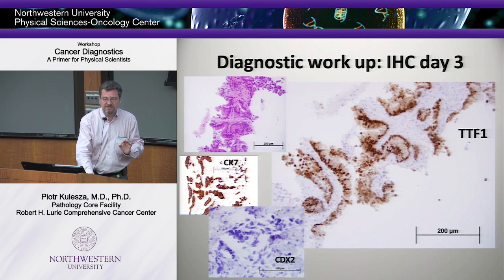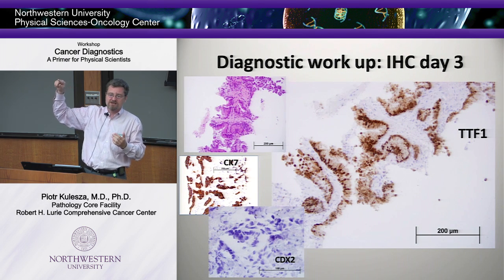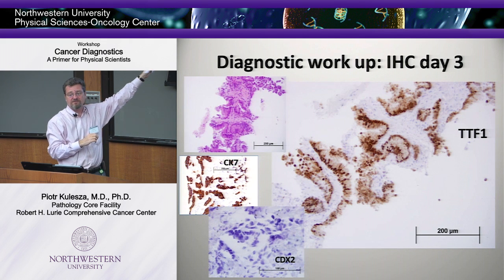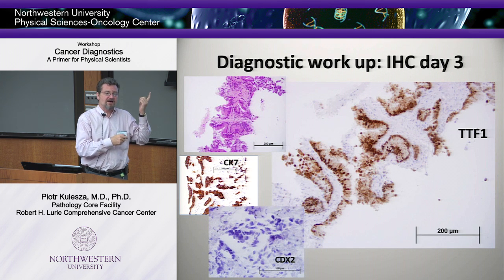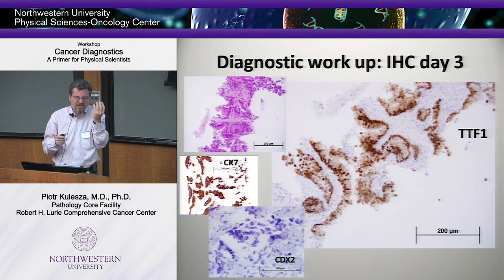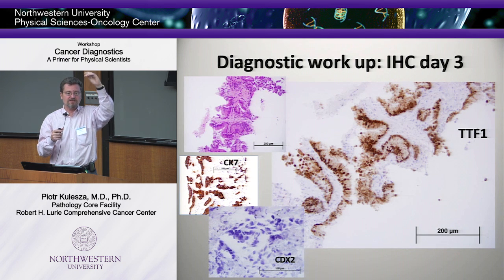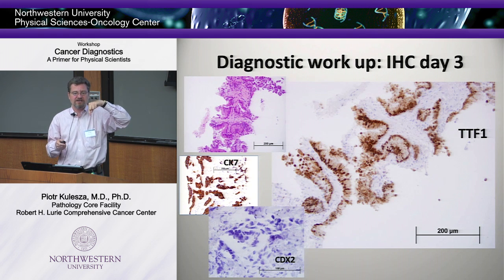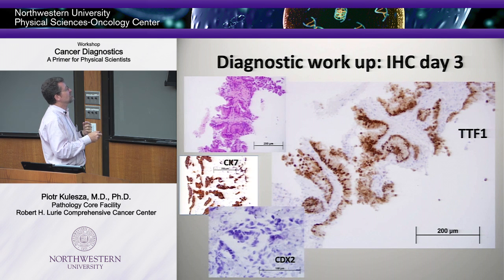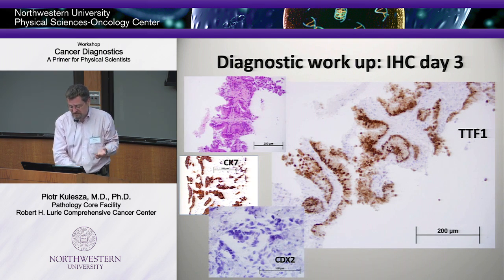So now, after doing this stain and applying these antibodies, then secondaries, and then using horseradish peroxidase to generate this brown stuff, right? Because the blue stuff is just hematoxylin. The brown stuff is diaminobenzidine, which is basically a chromogen, which, if everything bound correctly and specifically, then you have that horseradish peroxidase, which converts this and precipitates it right on the site of the antibody binding. Hence, you can tell that this is in the nucleus and this is all over the cytoplasm. Okay, so that's the very simple test. That is the mainstay, and this is what we do.